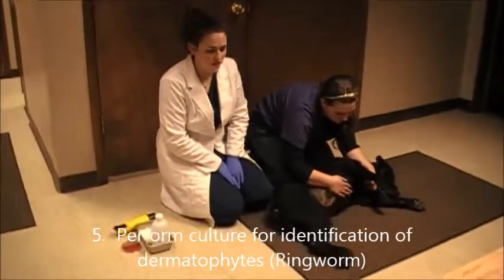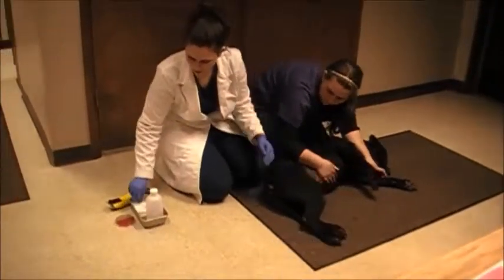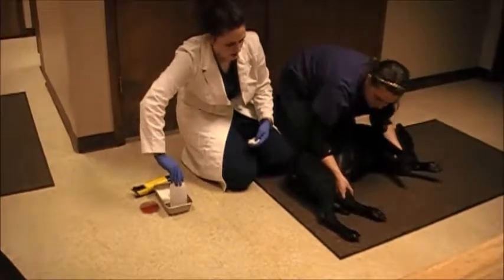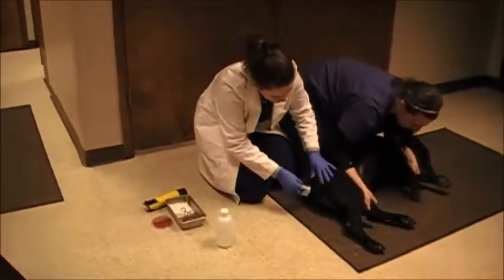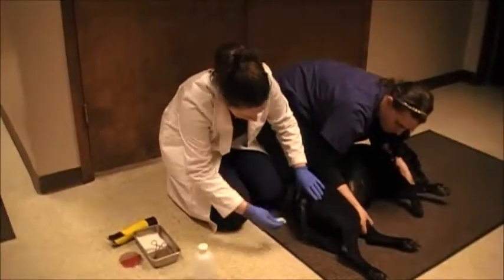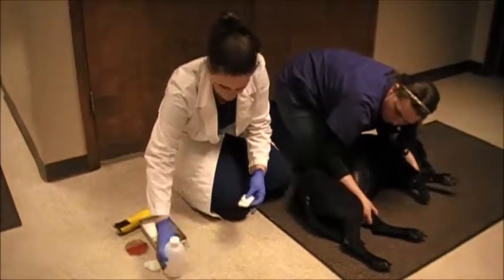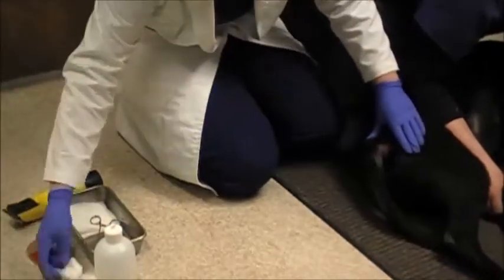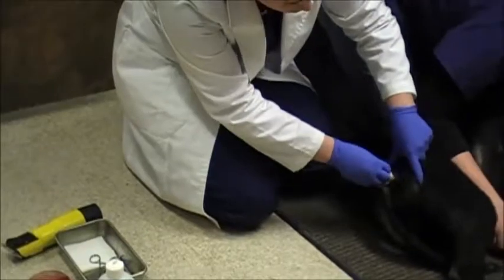I'm getting a sample for my dermatophyte testing, or ringworm testing. We're going to take a spot from this lesion back here. I'm going to use alcohol to wet down the area to make sure it's clean of any surface debris before I take a sample from that area. Then I'm just going to pat the lesion dry before we get our sample.